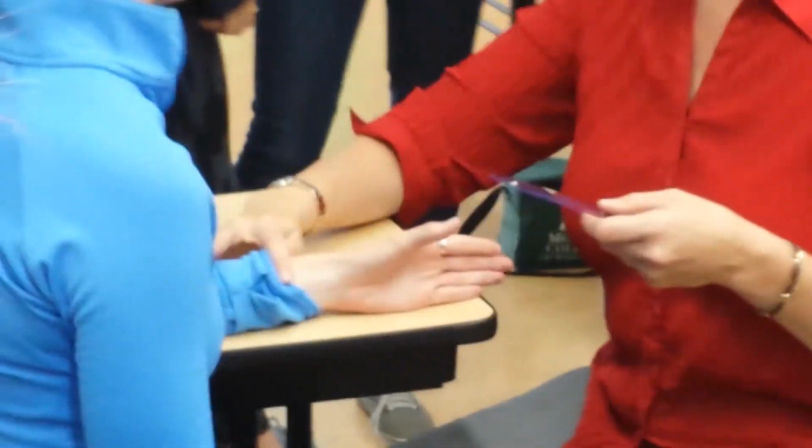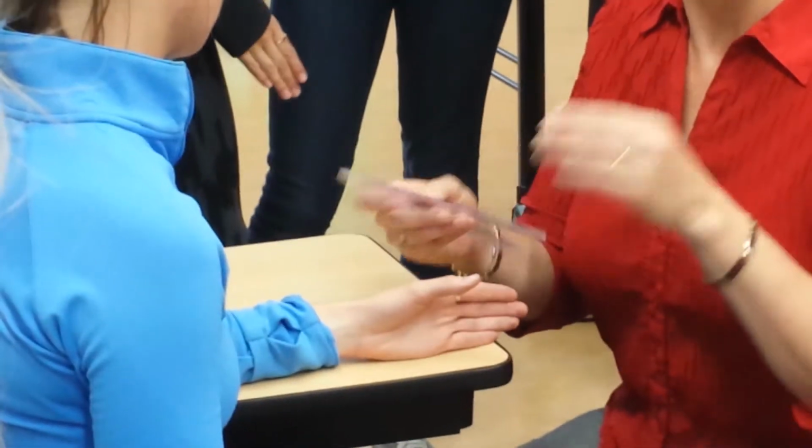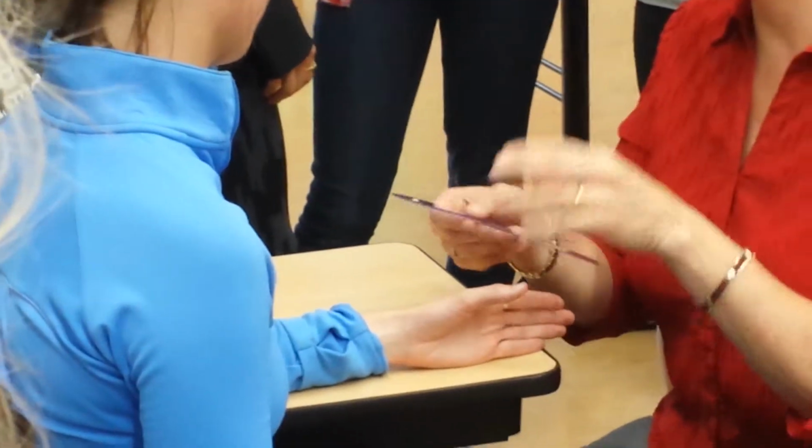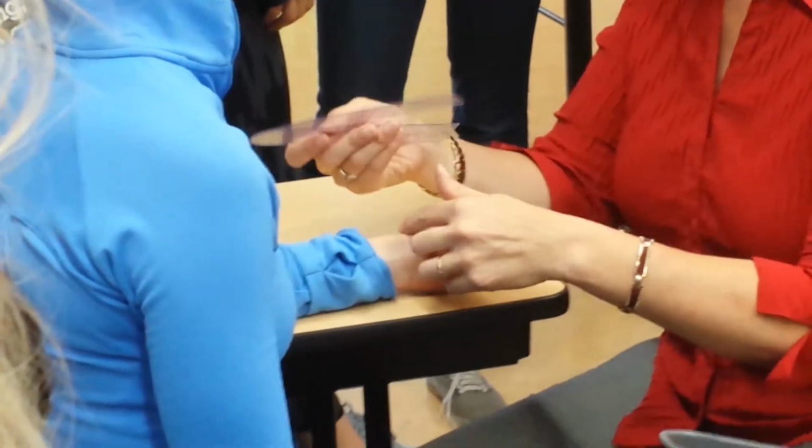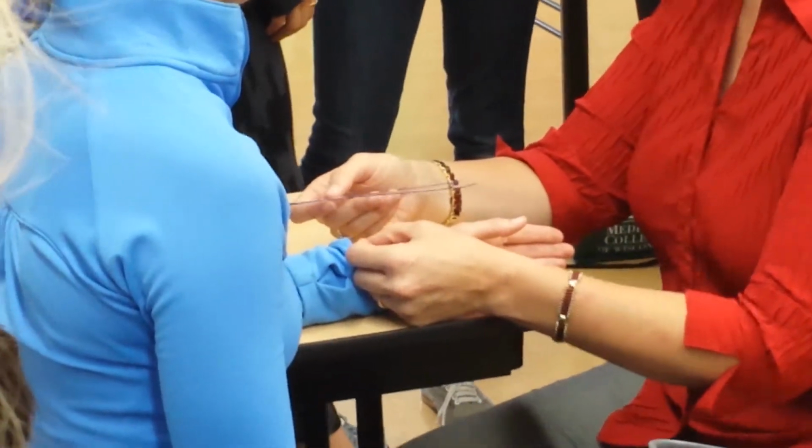Okay? So for this one, we're going to have our stationary arm line up with the second metacarpal. I'm always worried I'm going to say tarsal instead of carpal. We're not talking about feet yet. The moving arm is going to align with the first metacarpal, and the axis is going to be back on the radial styloid process. Okay?